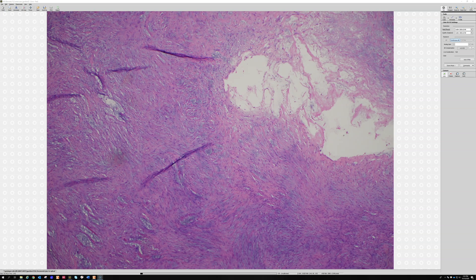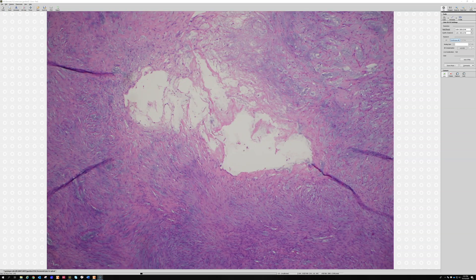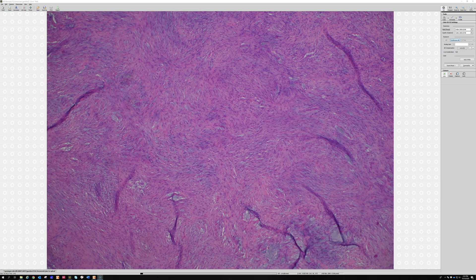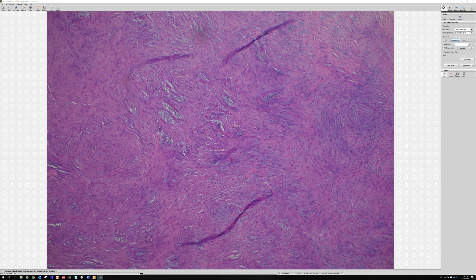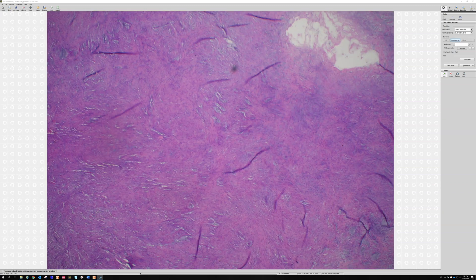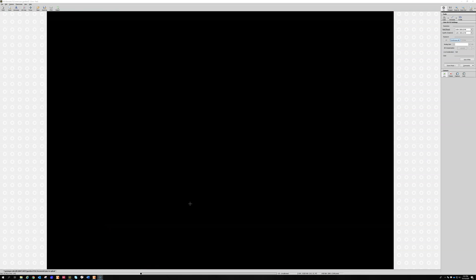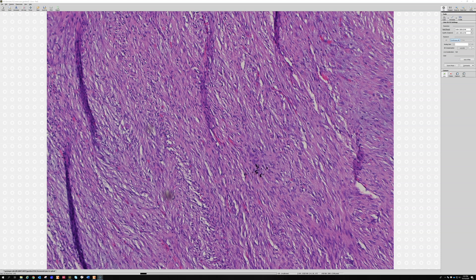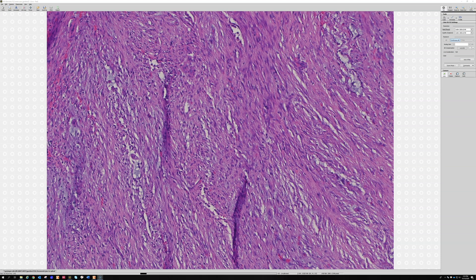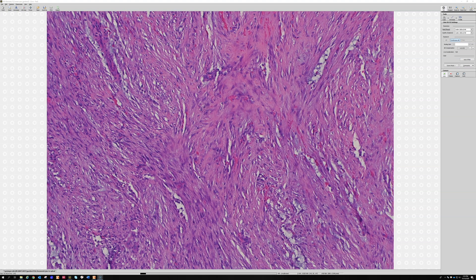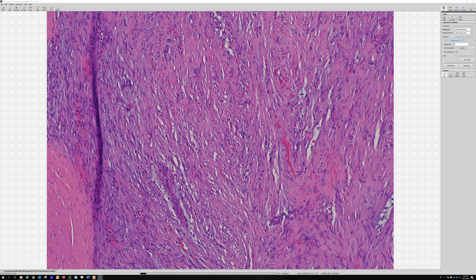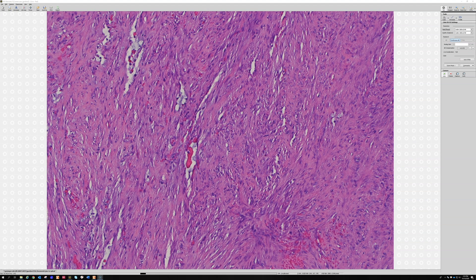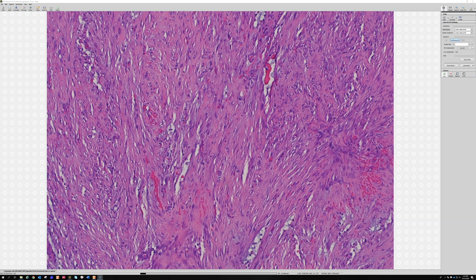Microcystic myxoid degeneration is really classic and present in the majority of nodular fasciitis cases; sometimes the cysts can be even bigger. Cellularity can vary from highly cellular to low cellularity as the lesion ages and burns out. Older lesions also tend to show more sclerosis and abundant collagen. The cells can be plump but should not have severe atypia or nuclear pleomorphism, though occasionally you see ganglion-like cells as in proliferative fasciitis or myositis. Mitoses are common and can be abundant, but you should not see atypical mitotic figures.